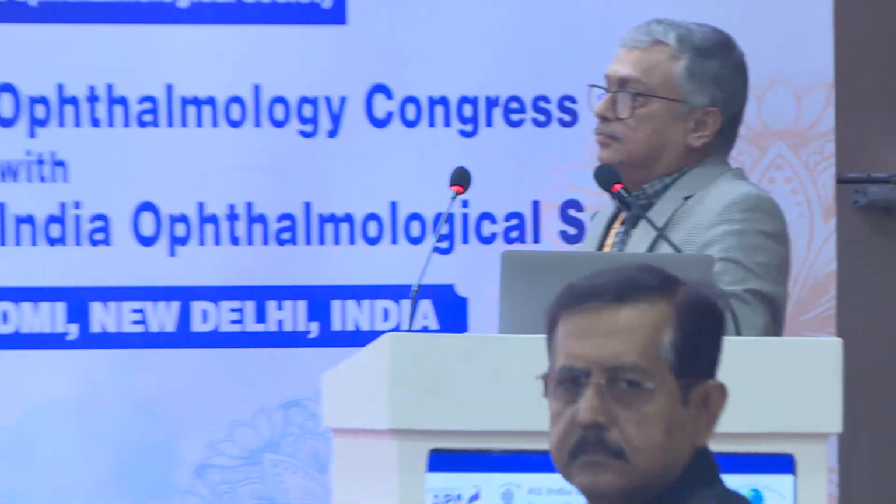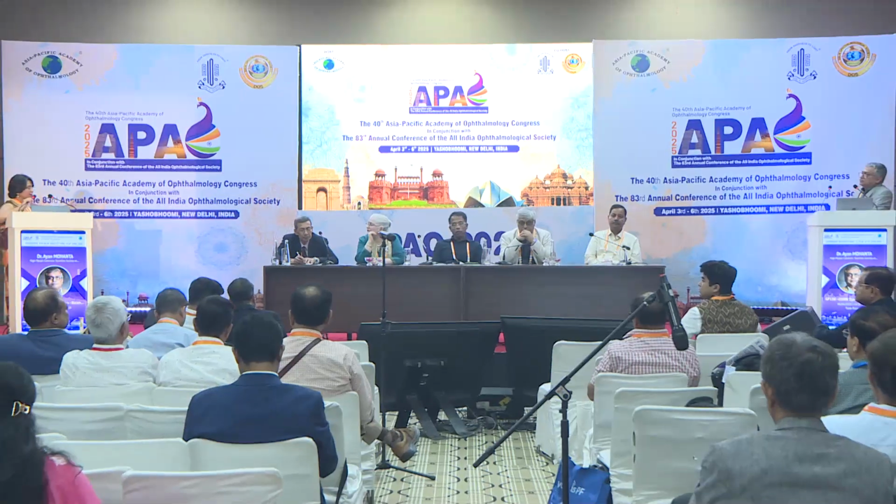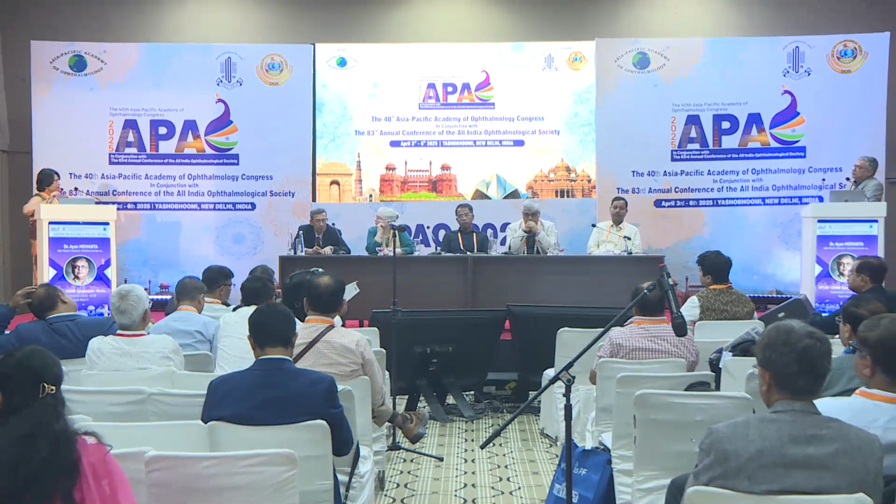That was very insightful, Dr. Ayan Mohanto. Before I go to the panelists, I would like to ask you a question. In biometry, you have impressed upon us that it is required to do a scan before deciding. Now, when do you actually go for this B scan? At which level of myopia do you start? A scan or B scan? B scan, sorry. A scan we are doing for biometry.